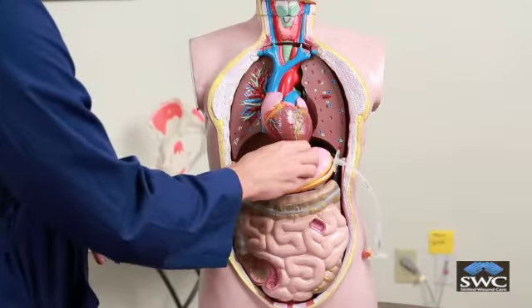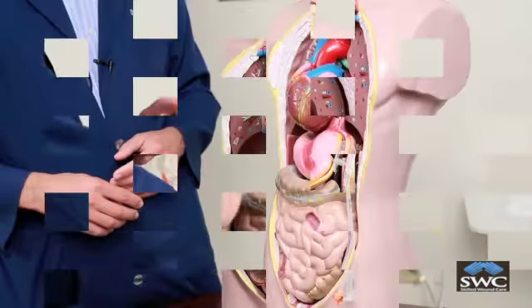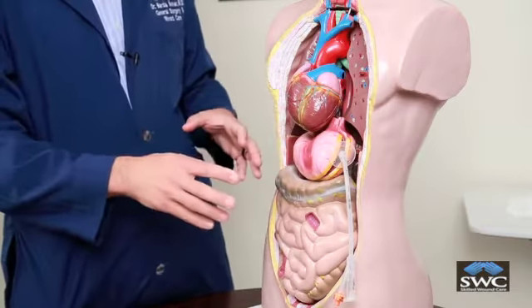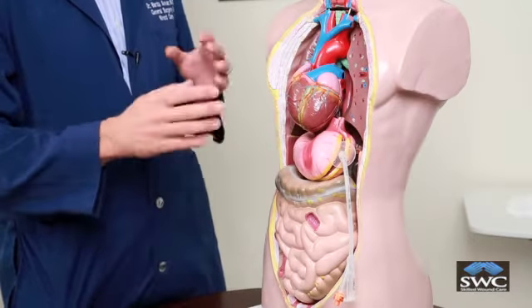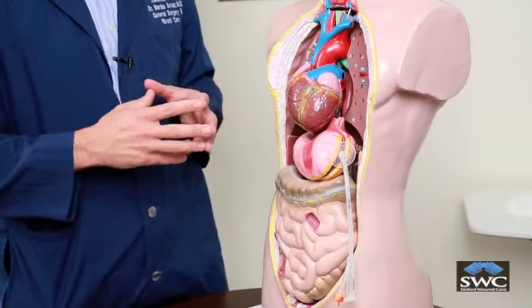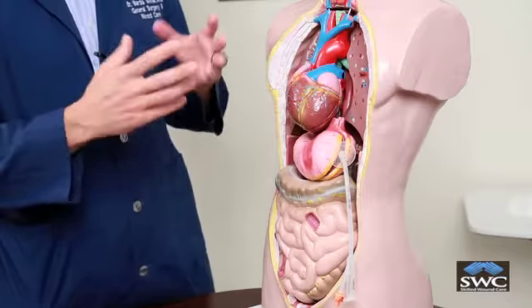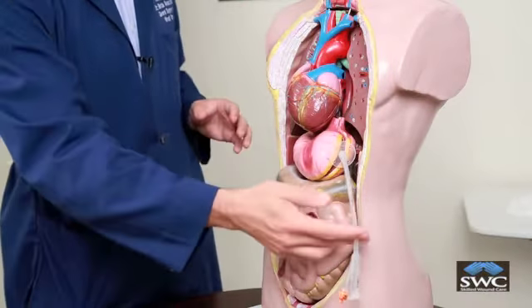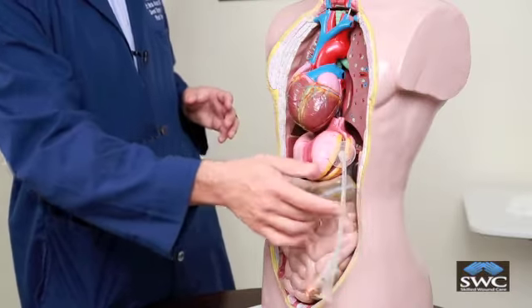This is, of course, your stomach. Your stomach goes down to your duodenum. When gastrostomy tubes are placed, there are two options. One is a percutaneous endoscopic gastrostomy tube, otherwise known as a PEG, or a surgically placed gastrostomy tube, which could either be a PEG, but usually it isn't, it will be a balloon type gastrostomy tube.